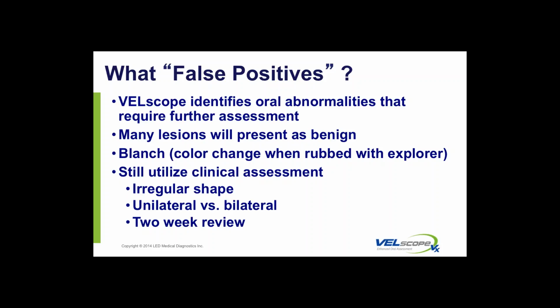I feel pretty confident we don't have that same criteria with VELscope in terms of that type of number, but part of that is subjective. But the reality is if you're following this process, you should feel very comfortable in terms of what you're seeing and what to do next with that patient.